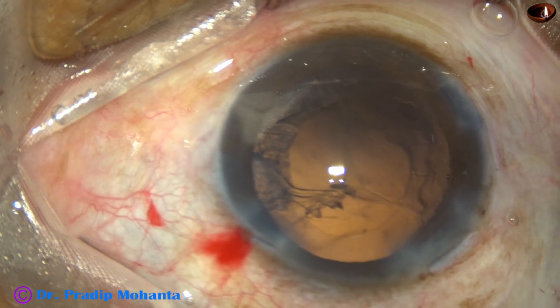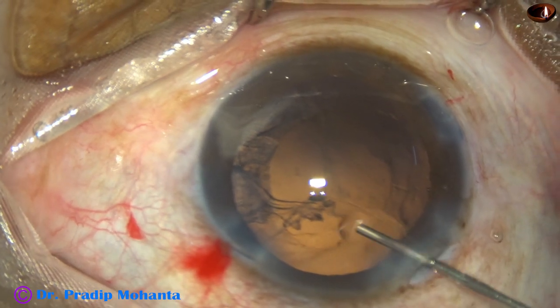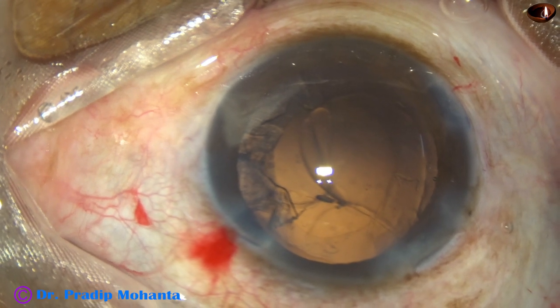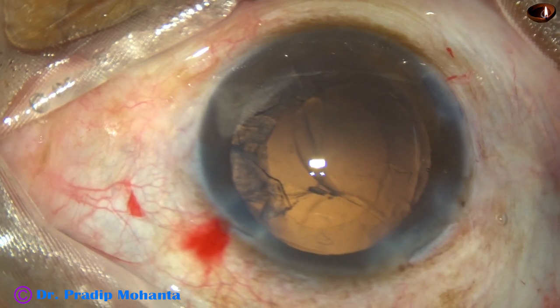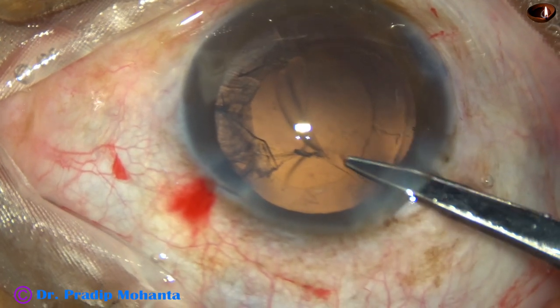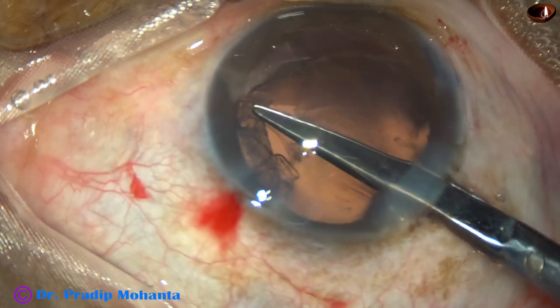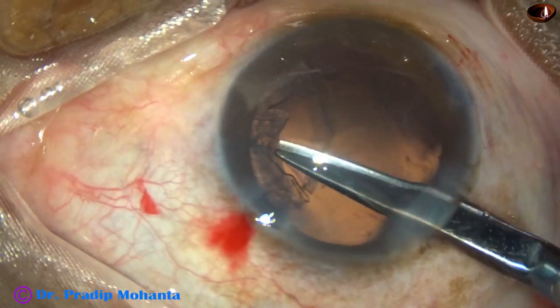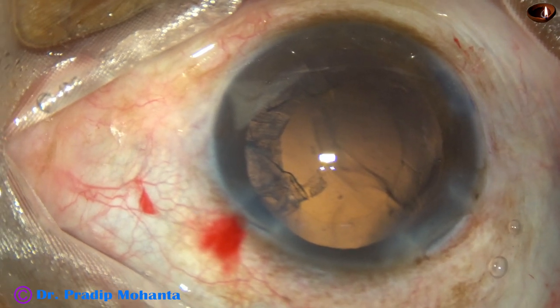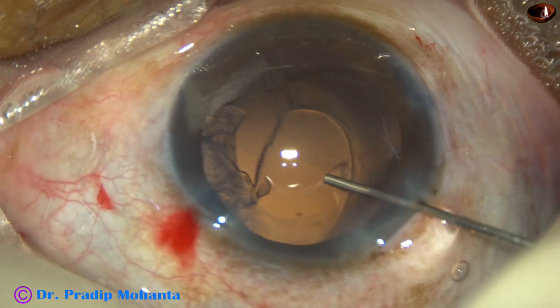Now the cortex from two o'clock to five o'clock — this is the trickiest part because the rent is right there. I find a strand coming and hooking the posterior capsule. I take a Vannas scissor and cut this strand, and I find that the posterior capsule is going back to its own place.